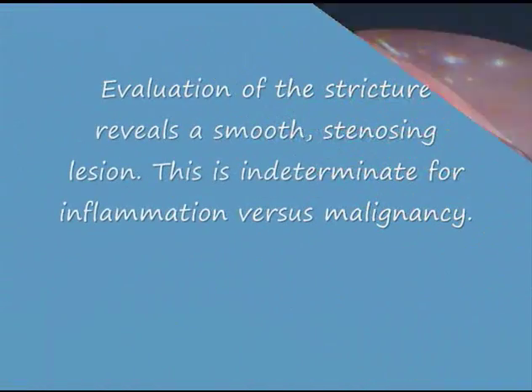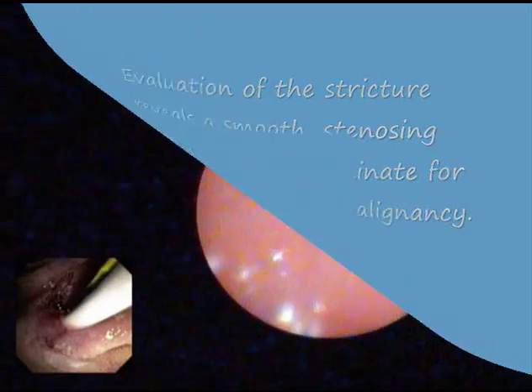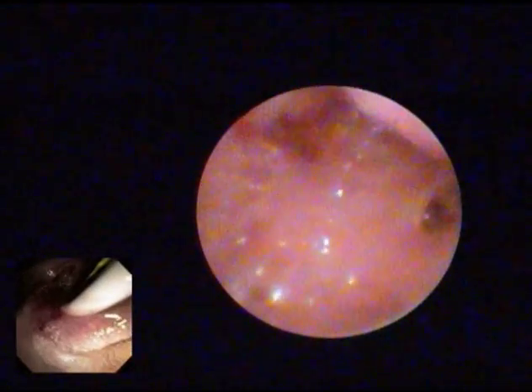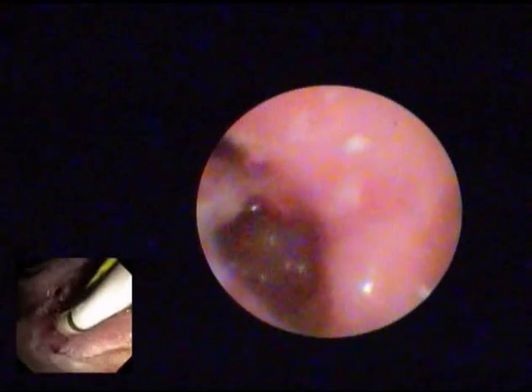Evaluation of the stricture itself reveals a smooth stenosing lesion; this is indeterminate for inflammation versus malignancy. Note the stricture as the pancreatoscope is pulled back through it.